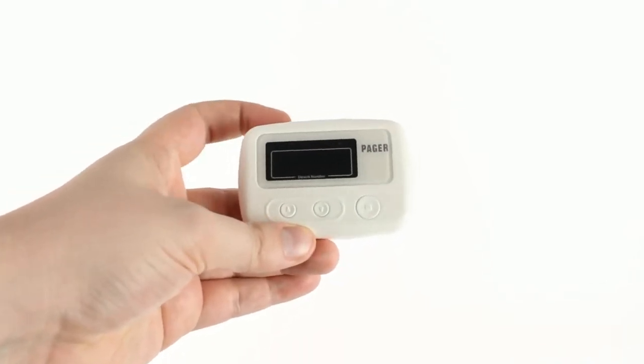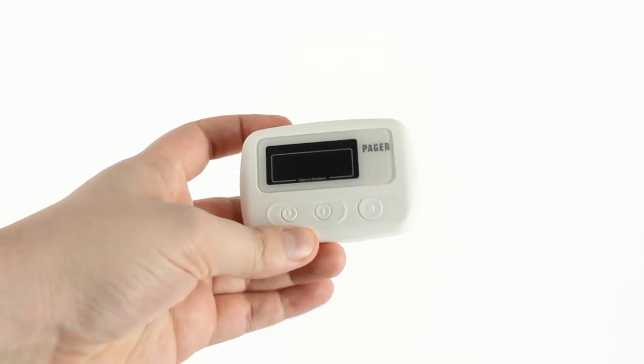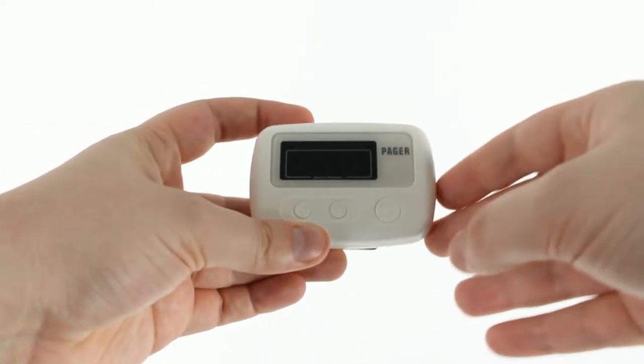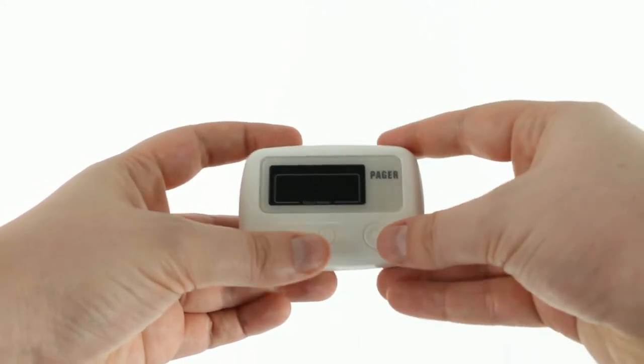This is just going to be a quick video on adjusting one of the settings on the Vive wireless bed floor chair alarm pager. Specifically, it's about adjusting the notification mode while the device is off.